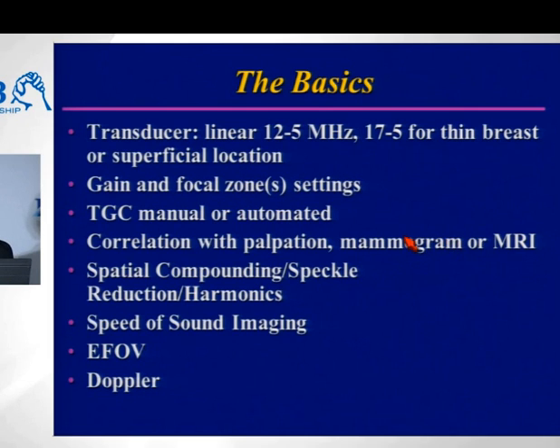If you see the mass on the mammogram, you have to know how to triangulate from the mammogram where in the breast to start to look with your ultrasound. And similarly with MRI. For this reason, it's particularly helpful if the radiologist doing the breast ultrasound also does mammography, and in the case of second look ultrasound also does MRI, because you really have to understand the subtle nuances of those other modalities to make the ultrasound work for you.